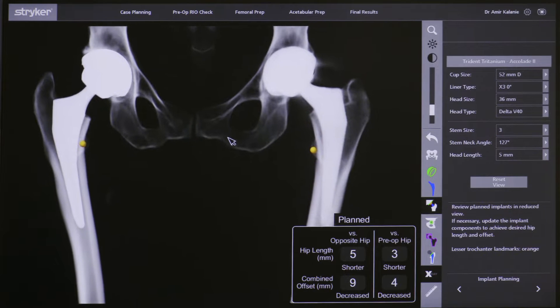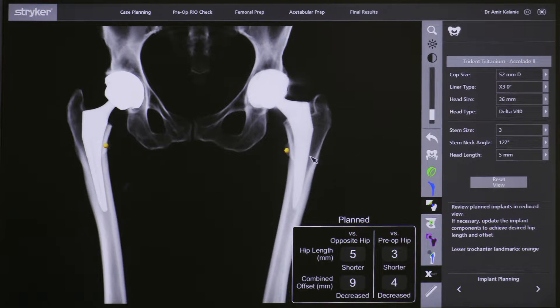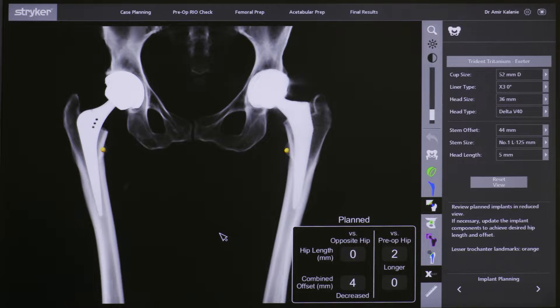Here I also get an x-ray image of the final prosthesis. This is what surgeons are used to looking at, and if I can look at the x-ray and confirm that it is perfect, it is very reassuring and provides another level of check that I can perform at this stage.